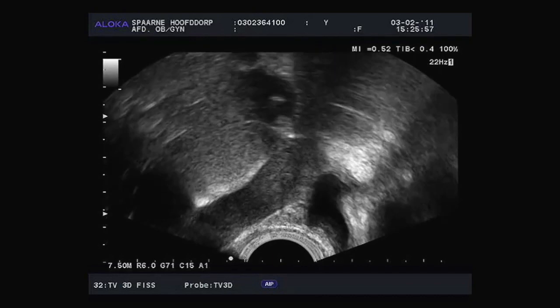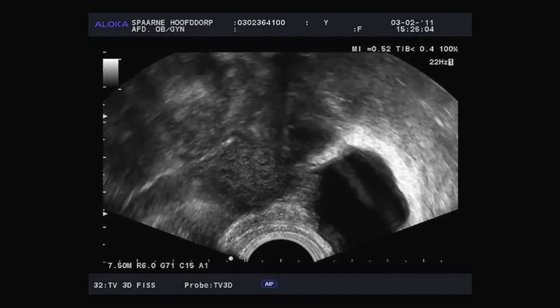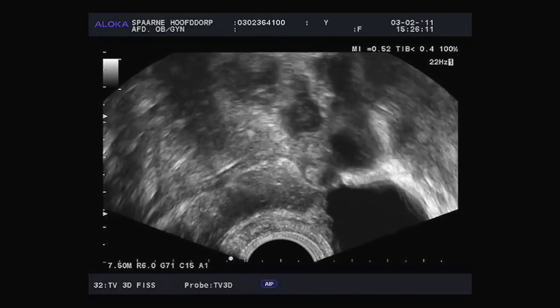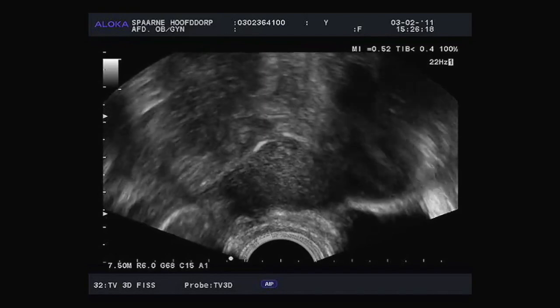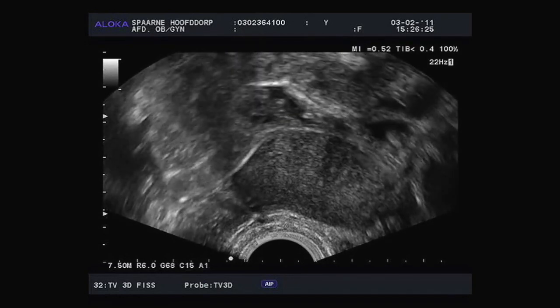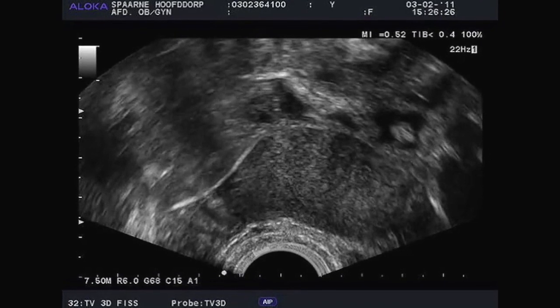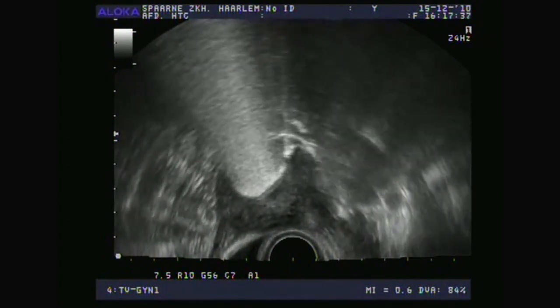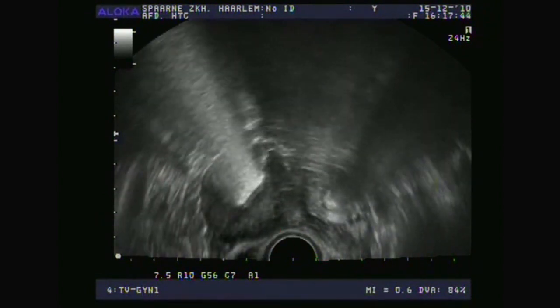At the end of the film, it becomes immediately and completely clear. I'll try to make this one as long as possible, turning with the tip of the ultrasound. Here you see that nice thin continuous white line. Now, if I freeze the image, you can see a beautiful fallopian tube, and if you look closely, you can even see the tube of foam bubbles. This funny white line is the foam. You cannot see the ovary so well on this side, but you can see the foam coming through very clearly. This is the ovary, and this is the foam next to it. This is how you know that the fallopian tube is open.